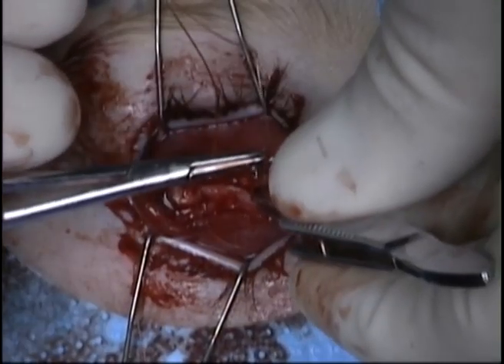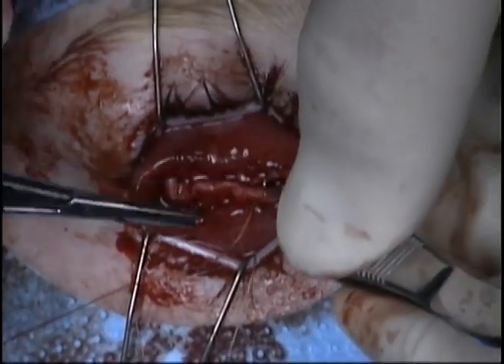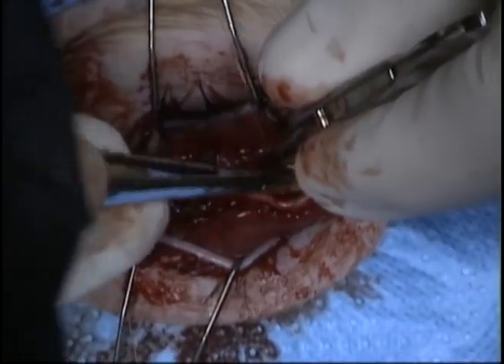This suture can sometimes be tricky to learn; however, recognizing how the imbrication should be performed will allow adequate and appropriate placement of the sutures.